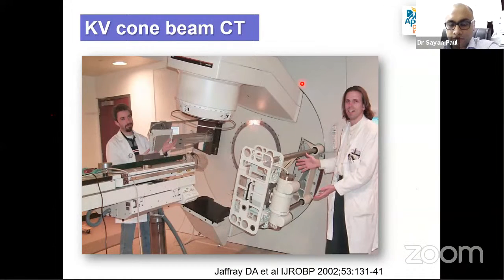So it can, as you know, the gantry can rotate. So the cone beam CT machine can come to any position and take images at any position without disturbing the patient. The patient is not moving, the patient is lying on the couch comfortably, the gantry is moving. So when you think that you need to take an image, you rotate the gantry, take the image. And when you think that yes, imaging is done, analysis is done, you want to treat the patient, your gantry rotates and you can treat with the treatment head.